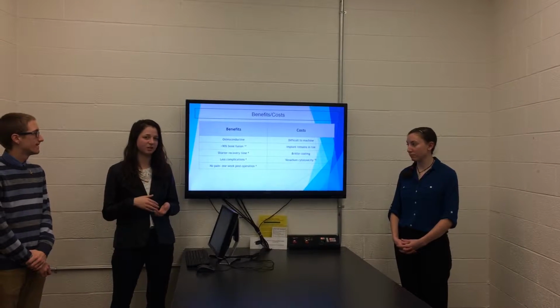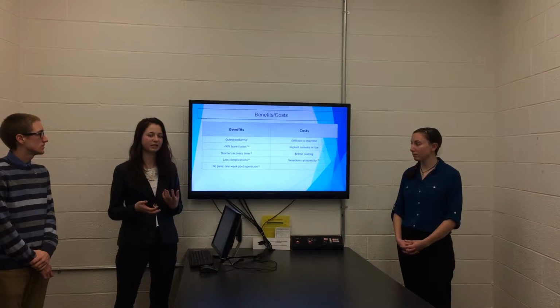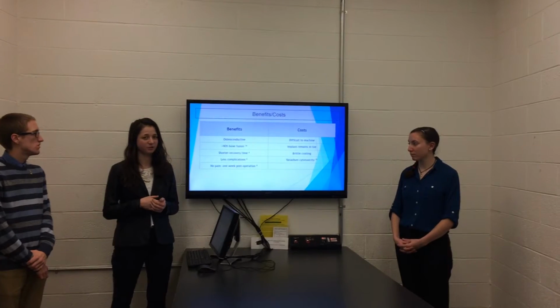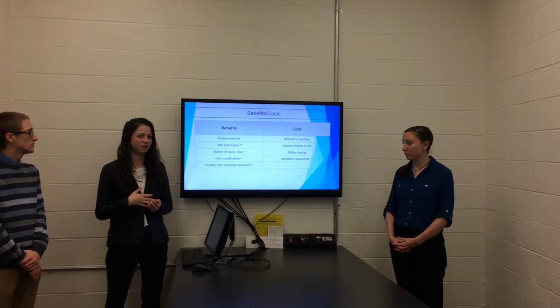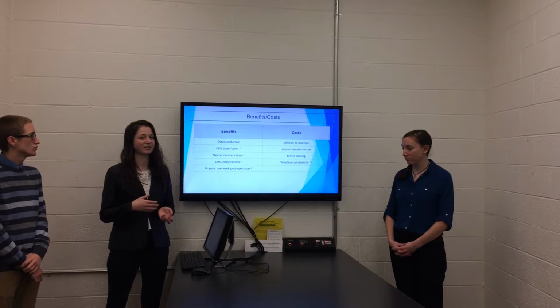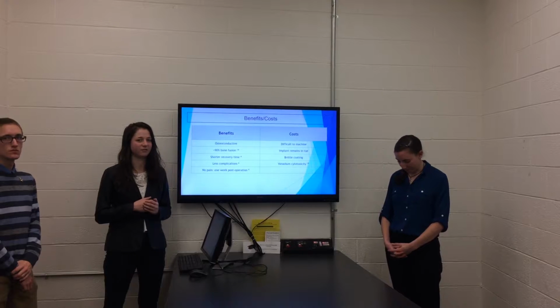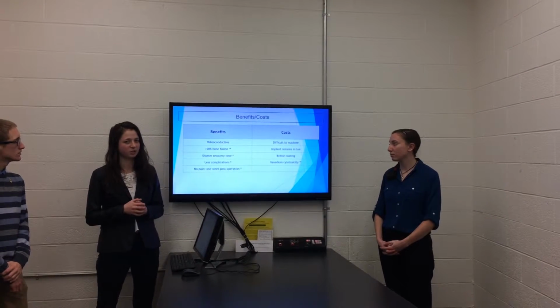Because it is completely internal and not percutaneous, there will be fewer complications such as infections as seen in K-wires, and because of the bone fusion, there will be less recurrence than K-wires. In addition, patients who have K-wire surgeries report pain up to 6 months after surgery, where we hope because of the fixation of our device, there'll be no pain within a week post-operation.